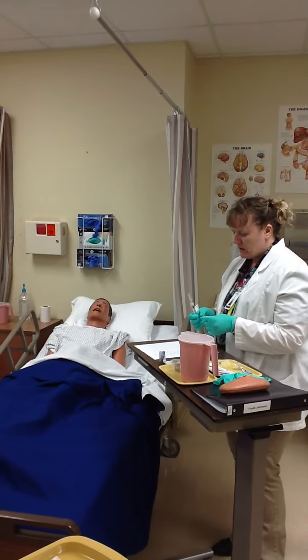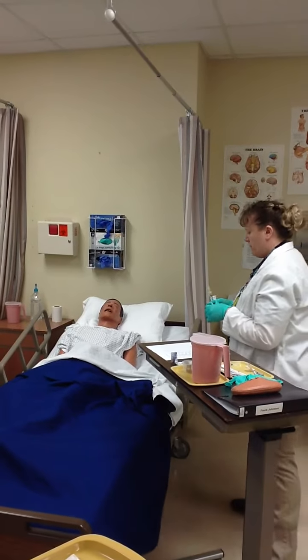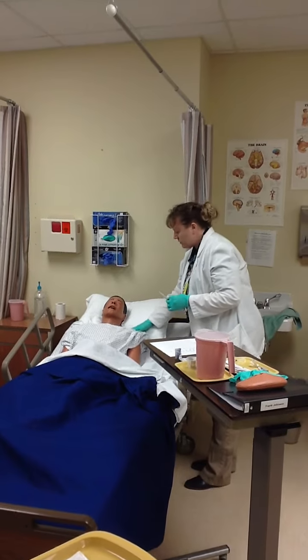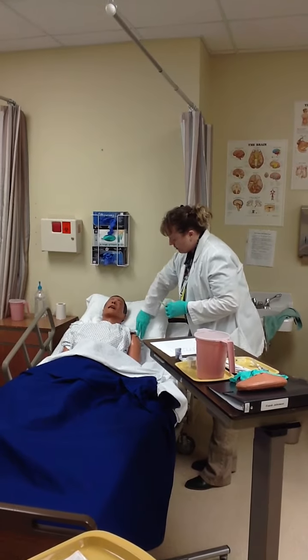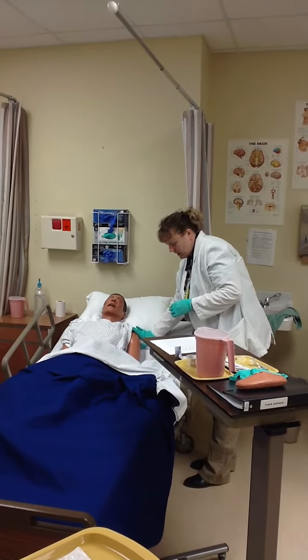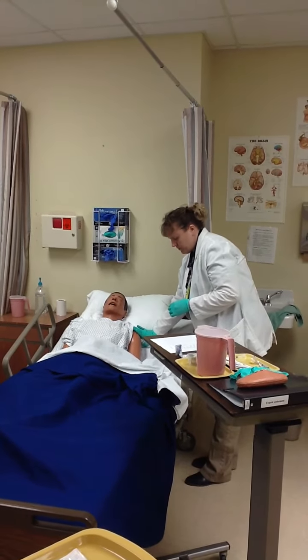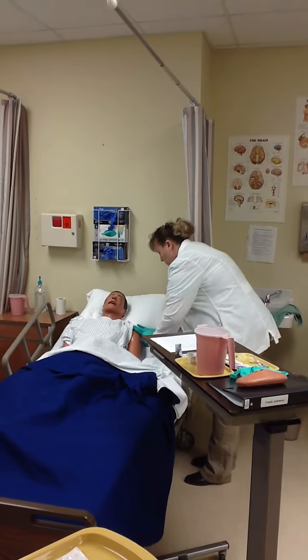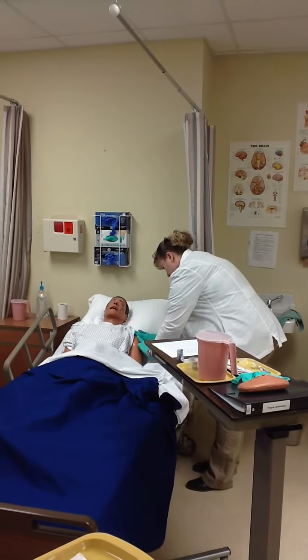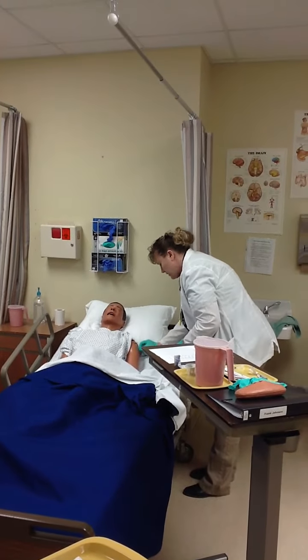I'm going to give this in his deltoid. To mark that site, I'm going to find that clavicle, find that bony prominence where the shoulder meets, go 2 fingers width below, mark my V, note where and cite that, and then clean that area off.